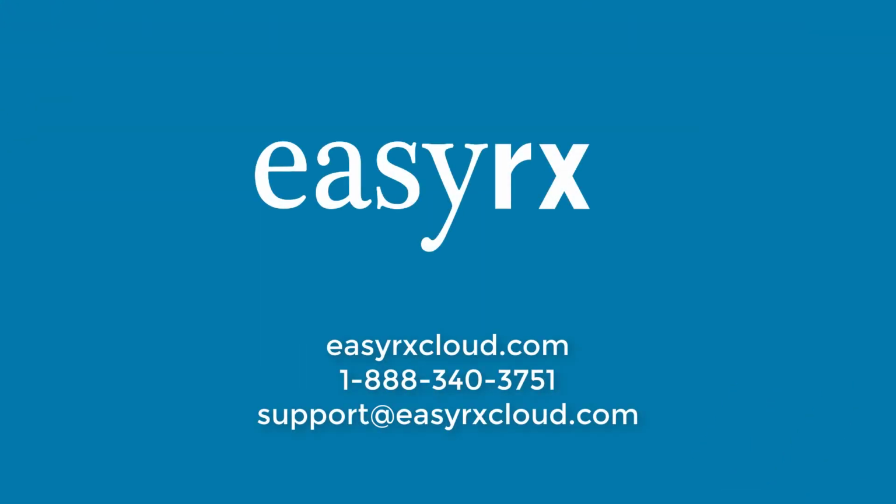We hope that the addition of the 3D Command Center and automated basing service will enhance your 3D workflow. If you have any questions or would like help getting set up with the EasyRx 3D Command Center or automated basing, please contact the EasyRx support team.